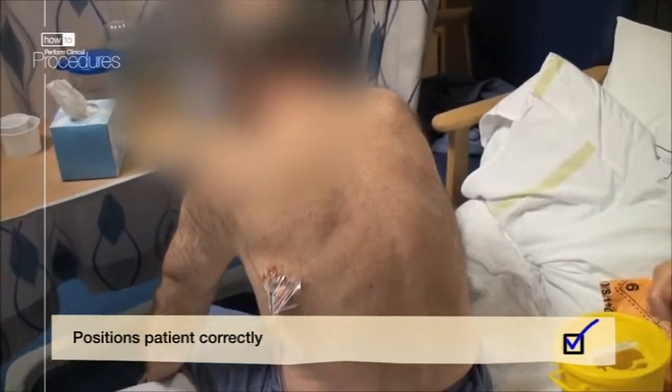The easiest and most comfortable position for the patient is sitting upright and leaning forward.